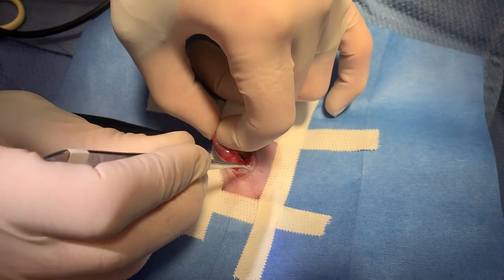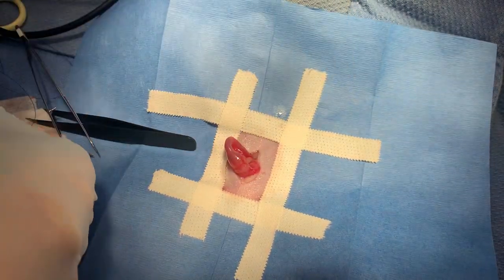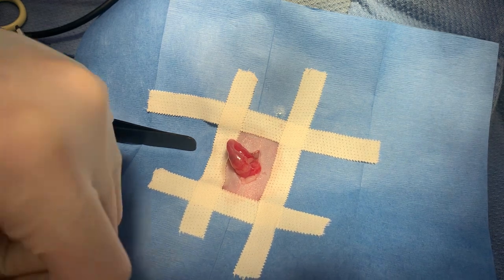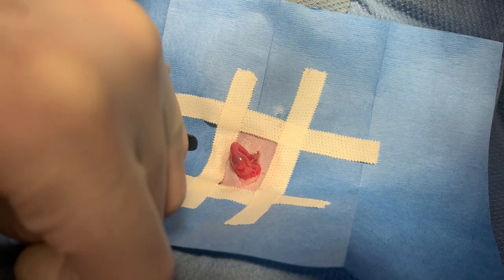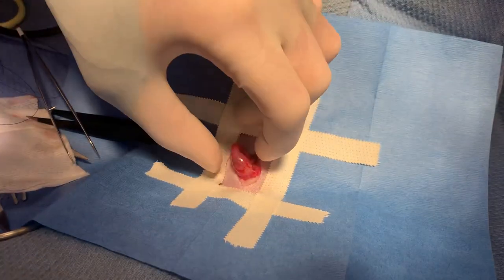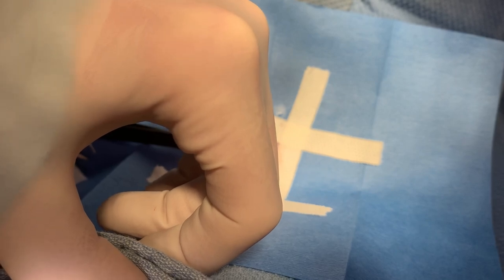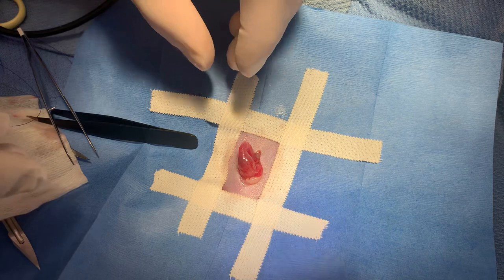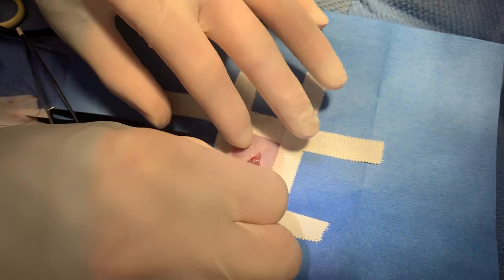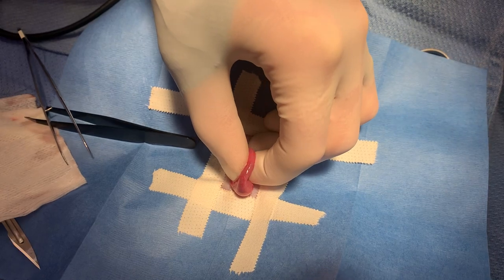So I do think that's the bladder. Whether or not that's abnormal, I do not know. Can't imagine it is. Could it be the yellow discharge that they're seeing, like a water infection or something? It could be. Do you want me to make a sample swab with that fluid? Yeah. We'll see if it's teeming with neutrophils and bacteria, or if it's maybe just normal.